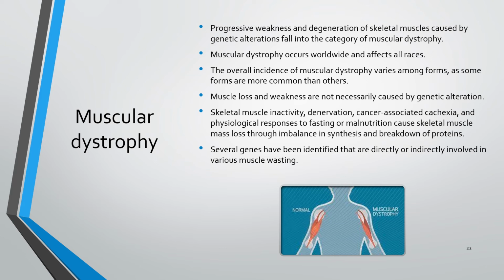As the skeletal muscles become inactive, there's a lot of problems with the diaphragm. So sometimes the diaphragm can't pull in. So inspiratory breaths are really impacted. So some of the tests you want to do with it is forced vital capacity or slow vital capacity. This is the one disease that really gets the whole smorgasbord of different pulmonary function tests.